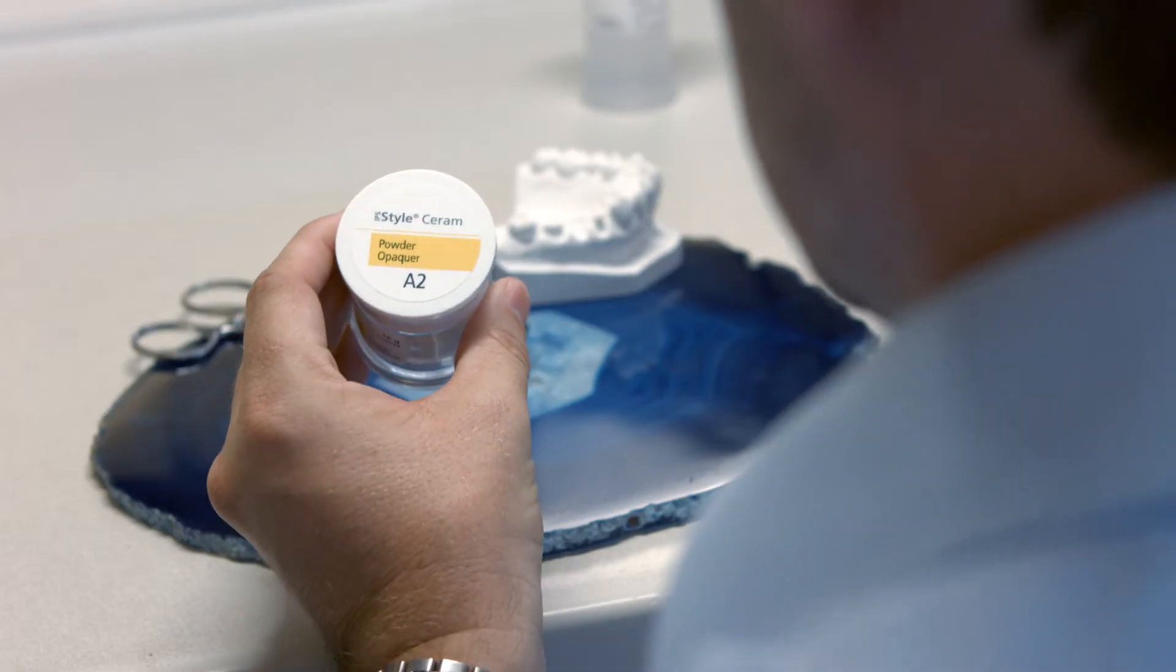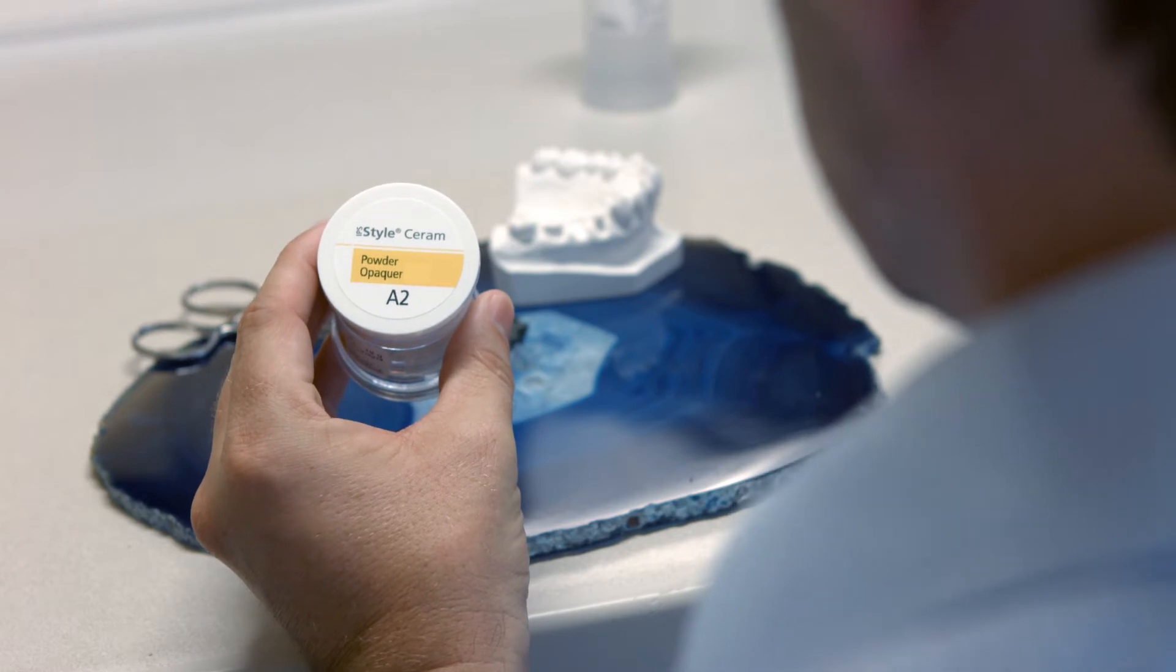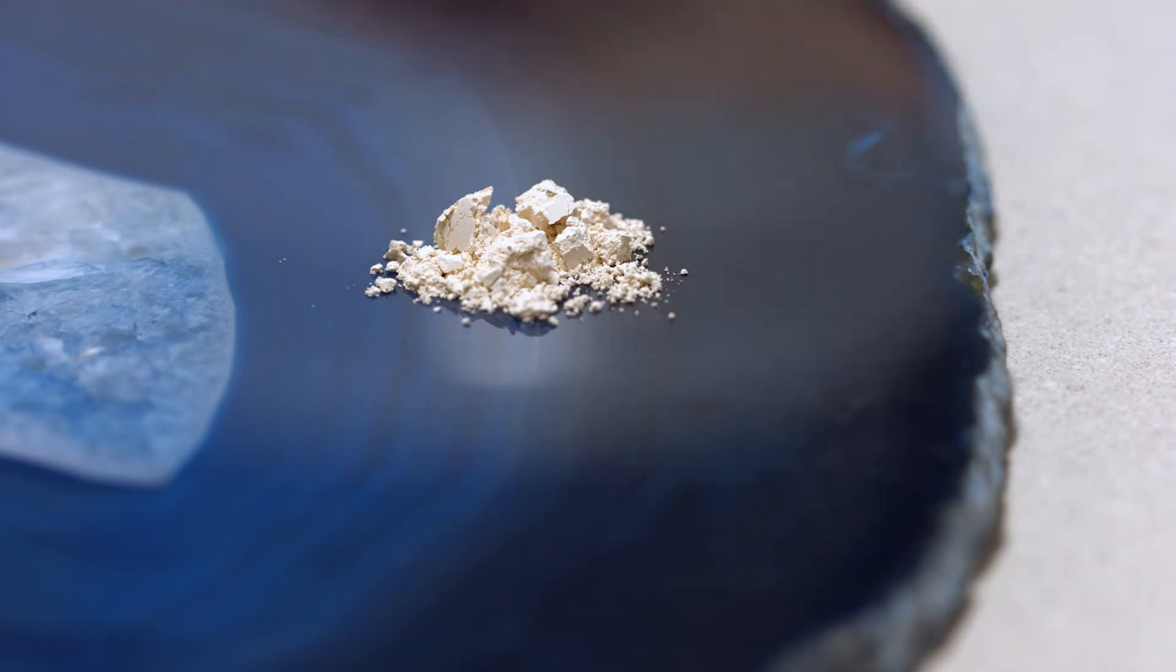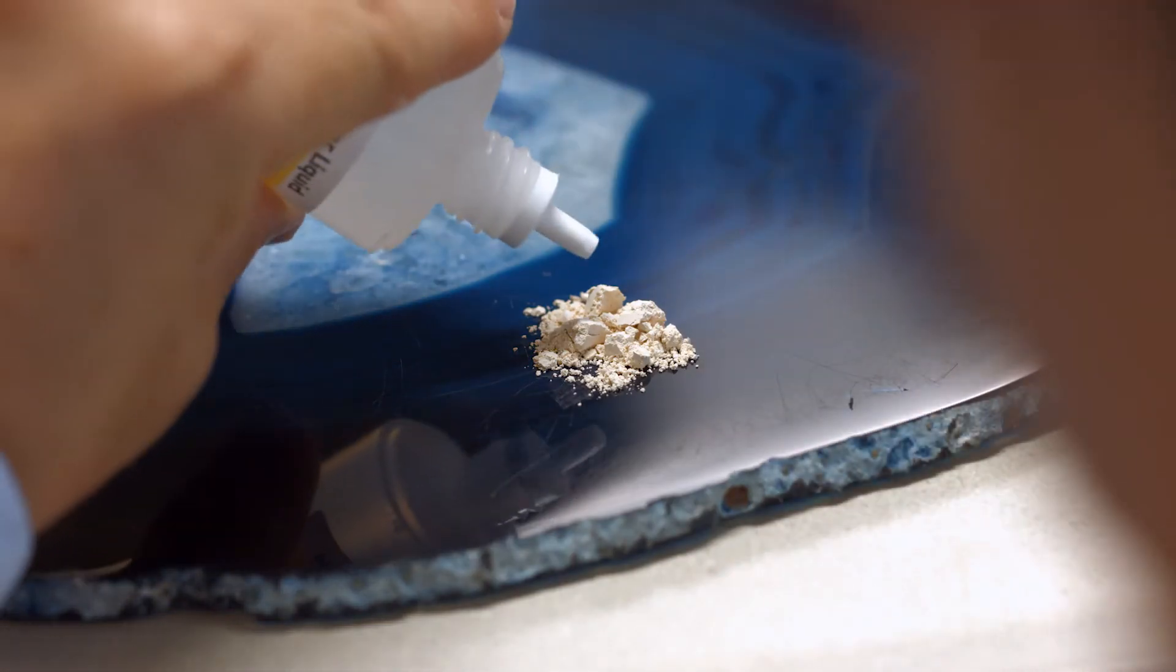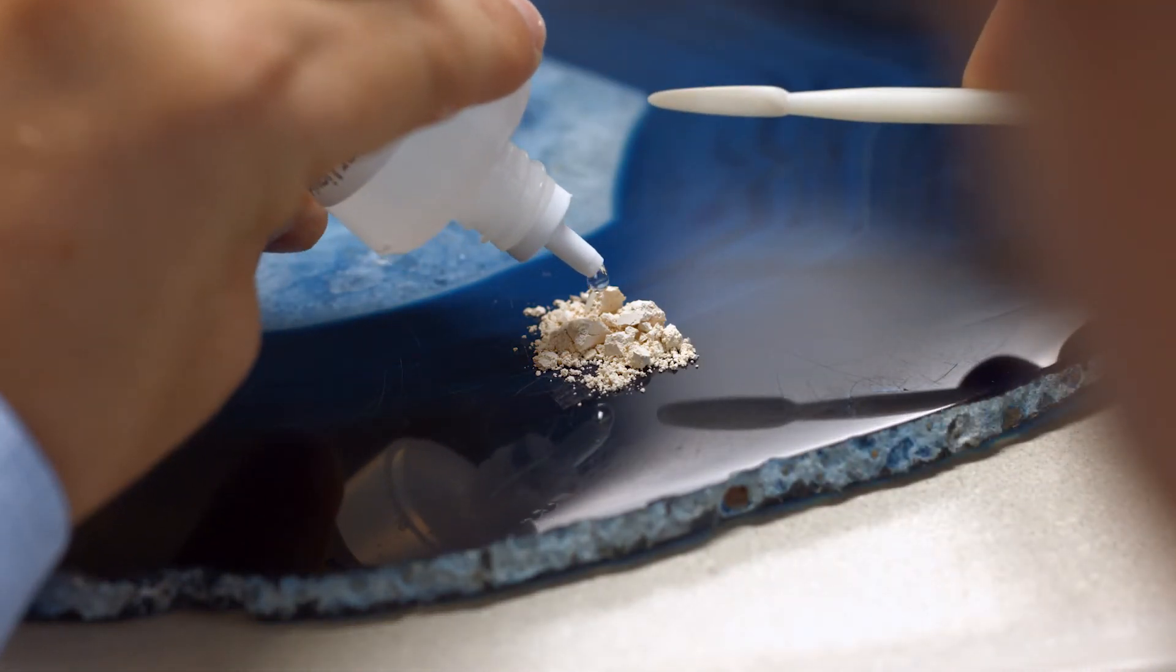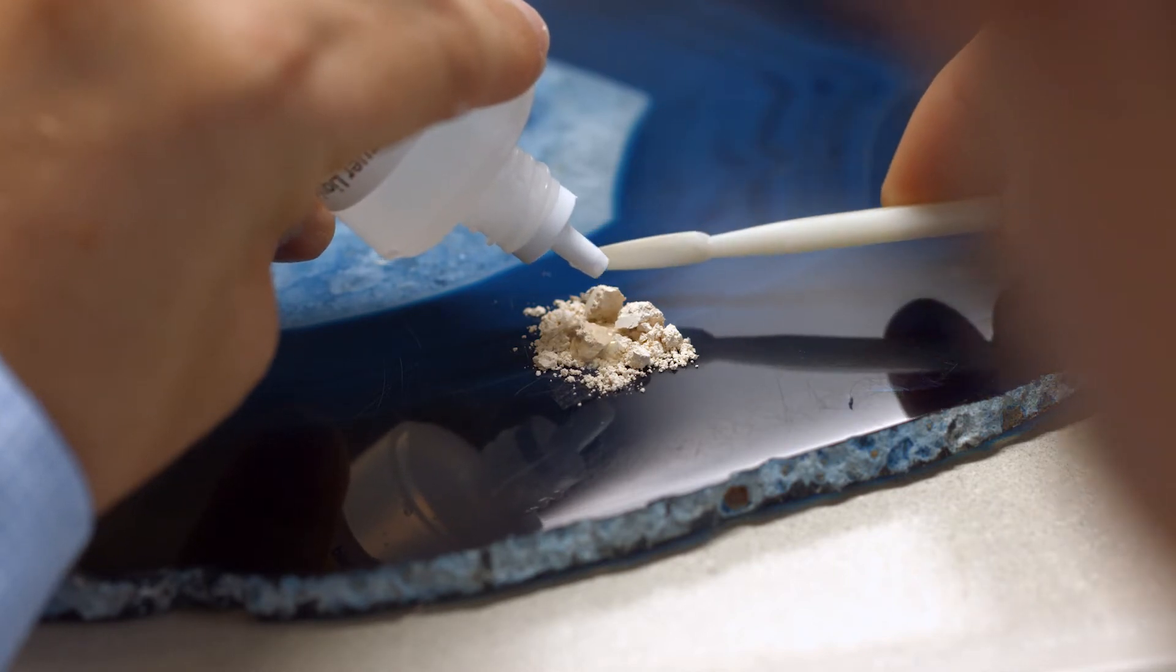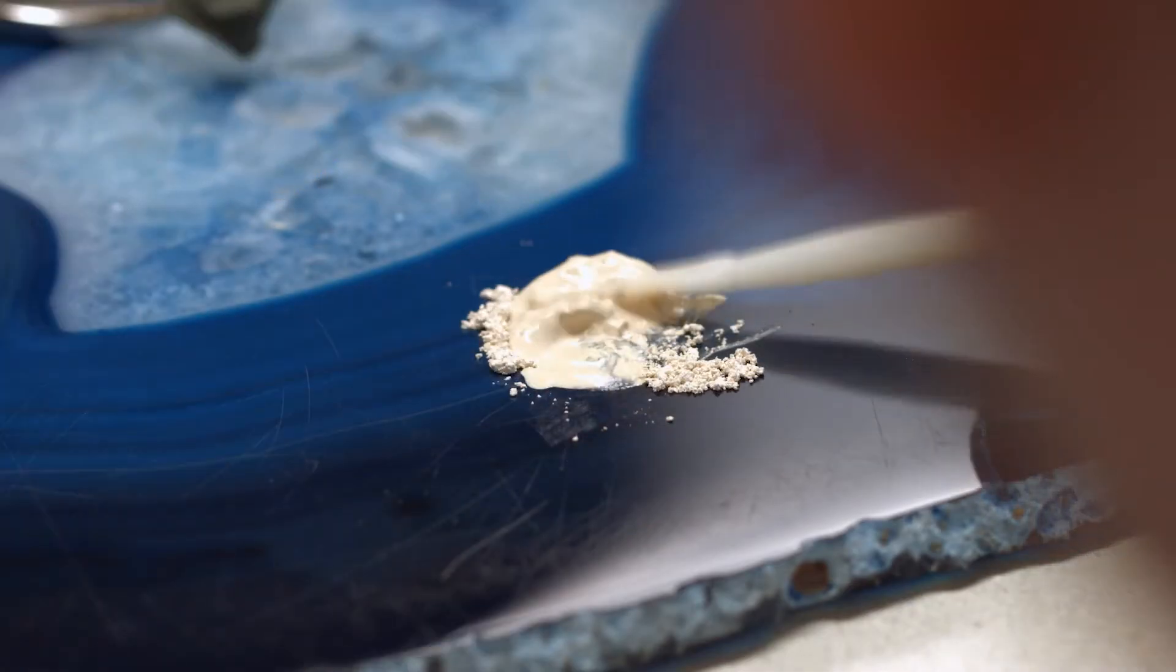Prepare the metal framework for the veneering procedure with IPS Style Ceram 1 by first applying and firing the opaquer. Mix the amount of opaquer powder required for the first layer with the IPS Powder Opaquer Liquid to achieve the desired consistency.